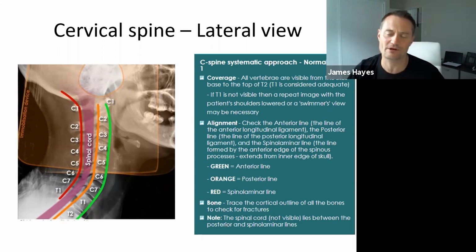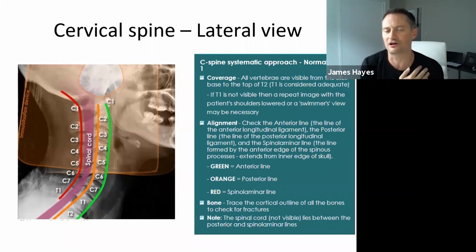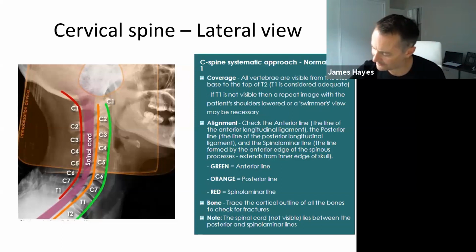So the best way of spotting a dislocated shoulder is actually clinically, because a patient will do this. If it's their right shoulder, they'll just hug their right arm into them and they won't move. And also, if you do get an AP x-ray, which is the most common, there'll be a decent gap. So it'll be lower, it'll be subluxed as well as dislocated, okay? But what I'll do is add lateral ankle and dislocated shoulder to the list.